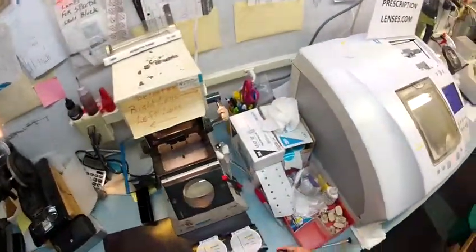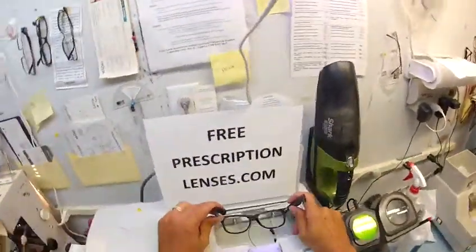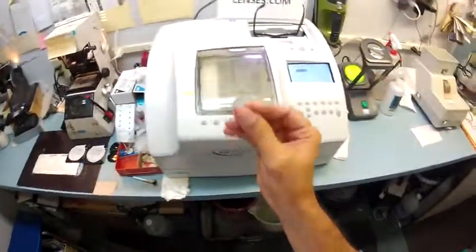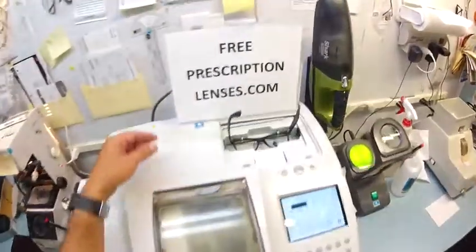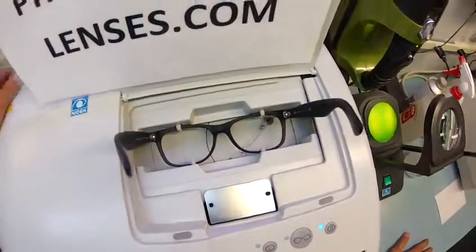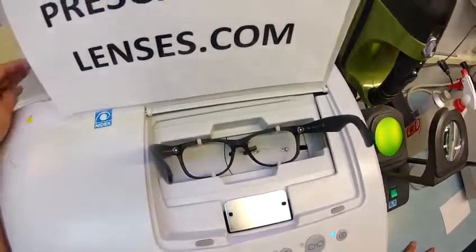So the first thing I'm going to do is pop out your original heavy glass lenses and cut some lightweight transition lenses for you. I'm going to put your Italian frame into my Italian Santinelli. This is the LE 1000 patternless edger and the stylus is coming up to trace the shape of your right lens, then it's going to move over and trace the shape of your left.